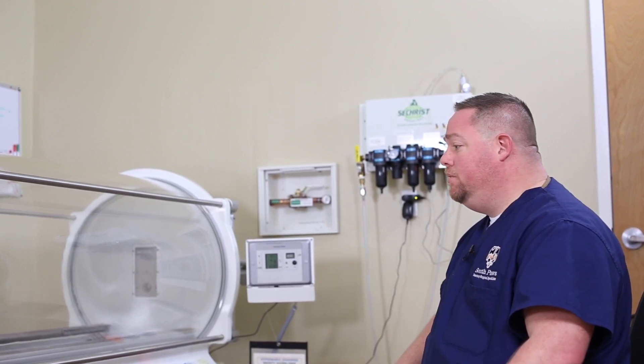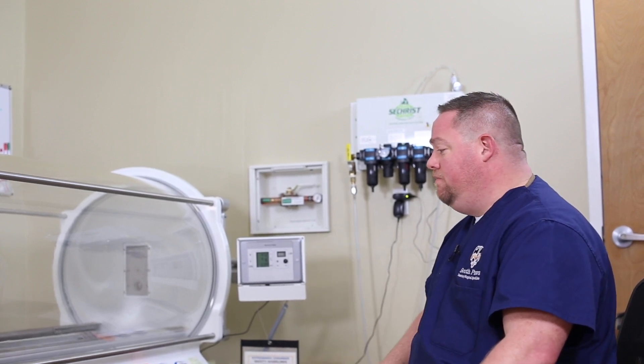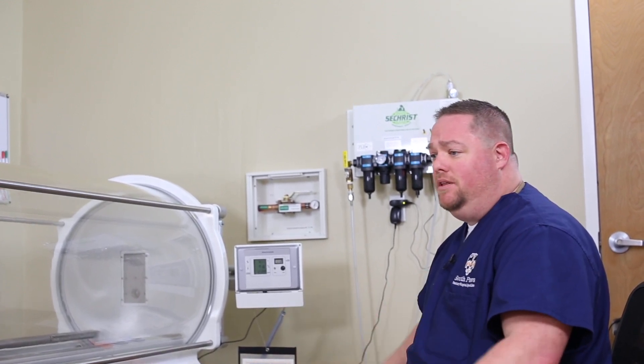Overall, I couldn't be more pleased. It's been a great addition for us. We're running anywhere from 150 to 200 treatments a month in this chamber. It's an absolutely phenomenal piece of equipment with great customer support — the guys at Sechrist are phenomenal about helping us work through and troubleshoot little things. The initial installation has been really carefree. We haven't had any issues at all, so it's been a great experience so far.